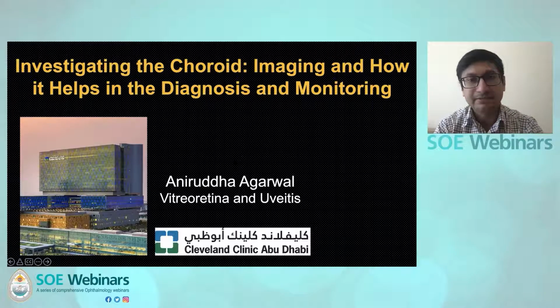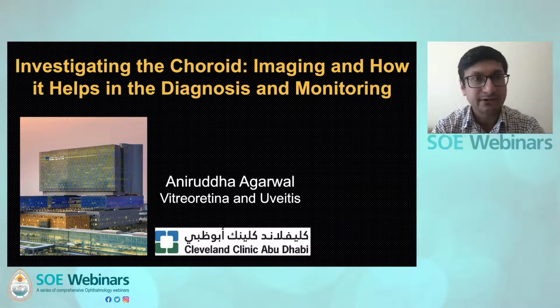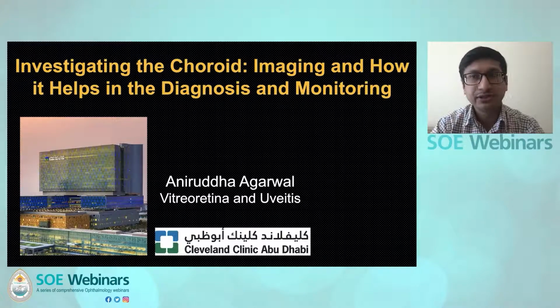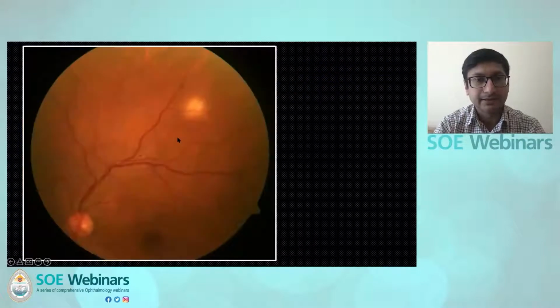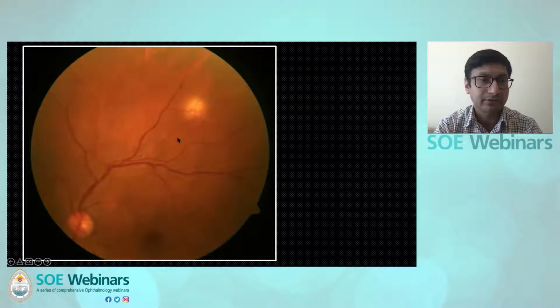Greetings from Abu Dhabi. My name is Aniruddha Agarwal, and it's my pleasure to be here with you. Thank you, Team SOE, for this opportunity to present my topic on investigating the choroid imaging and how it helps in the diagnosis and monitoring. At the outset, let me quickly go to my case. This is a patient who presents with a yellow lesion in the superior retina of the left eye. One clue to the diagnosis here is that he's an Asian Indian male.